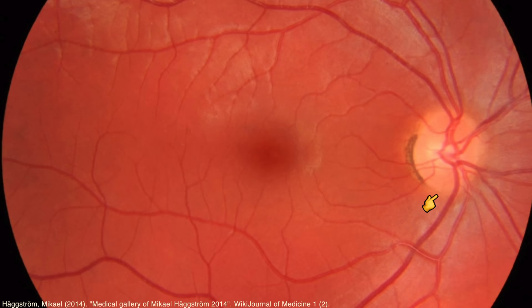We've got the fovea, the optic disc, and this broad expanse of redness - the retina covering the rods and cones, the sensitive ends of the nerves that allow us to see. The rods are sensitive to light on its own, whereas the cones allow us to see colour as well. Spreading out across the retina we've got the veins and the arteries, specifically becoming venules - almost at capillary level, the smallest unit of vein - or arterioles, the smallest unit of artery, before they become the capillaries. This is where we can non-invasively see those finest blood vessels and crucially pick up on early damage due to disease - hence diabetes.